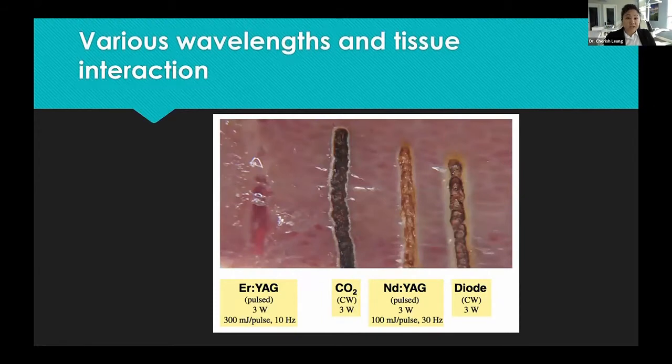Here's another image of what I just discussed. So you can see here, you can see the diode laser here. You get that charring look. Again, you're gonna get that smell when you do it. I've done frenectomies with a diode prior to using the Waterlase, and you really do get a lot of that smell, and parents really do worry that you're hurting the child when you're doing that.